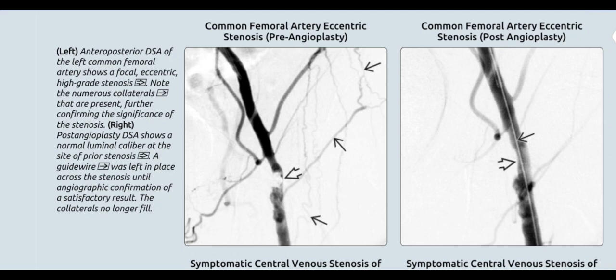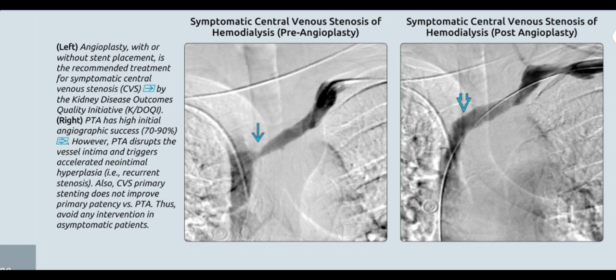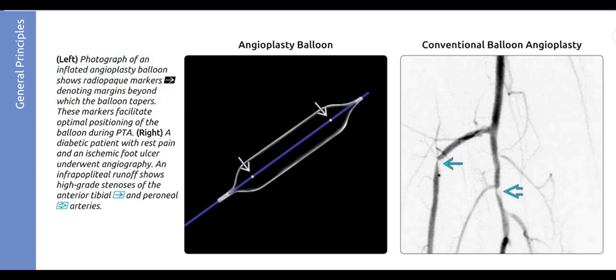A right internal iliac angiogram shows multifocal areas of extravasation, which were treated with Gelfoam embolization. The patient was ASA class 5E. Anteroposterior DSA of the left common femoral artery shows a focal eccentric high-grade stenosis with numerous collaterals confirming the significance of the stenosis. Post-angioplasty DSA shows normal luminal caliber at the site of prior stenosis; a guidewire was left in place across the stenosis until angiographic confirmation of a satisfactory result, and the collaterals no longer fill. Angioplasty with or without stent placement is the recommended treatment for symptomatic central venous stenosis per KDOQI; however, PTA disrupts the vessel intima and triggers accelerated neointimal hyperplasia, and primary stenting does not improve primary patency versus PTA — thus avoid intervention in asymptomatic patients.